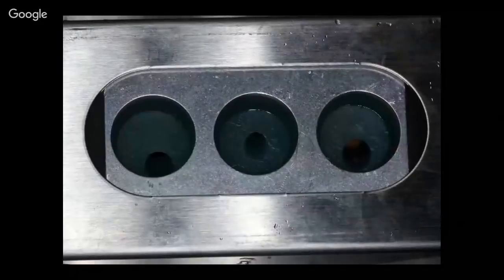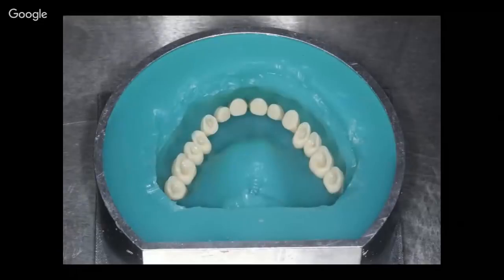All right, so when we close the flask back up, we've got now basically all the teeth in there, and everywhere where the gray base had been, the area between the agar and the model is now going to be a void or a negative space in which you can pour the acrylic. All right, this is a great picture showing the underside of those teeth.